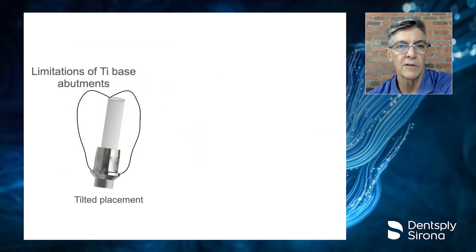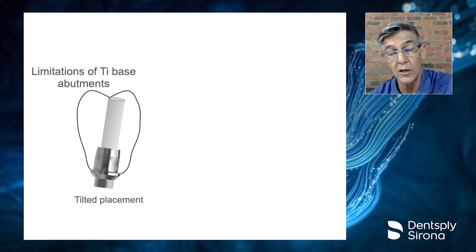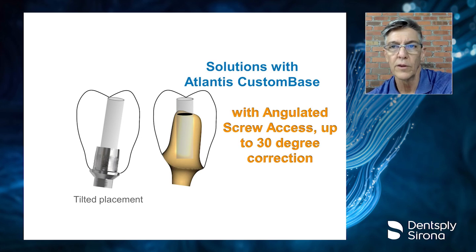The other limitation of a TiBase design is when you have a tilted placement of the implant, which does happen, particularly in the molar region, where it's hard to get the drill apparatus in a vertical position when placing the implant. Well, with a CustomBase, we are able to change the access channel so that it's in a much more opportune location for us, and we don't compromise our crowns that way.